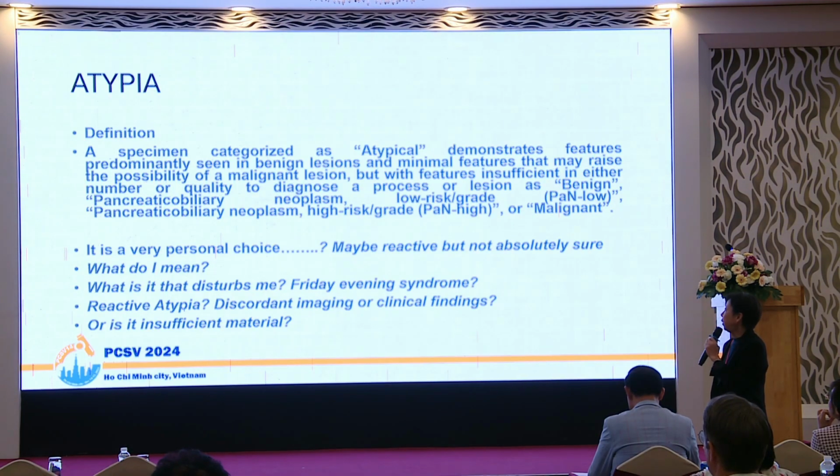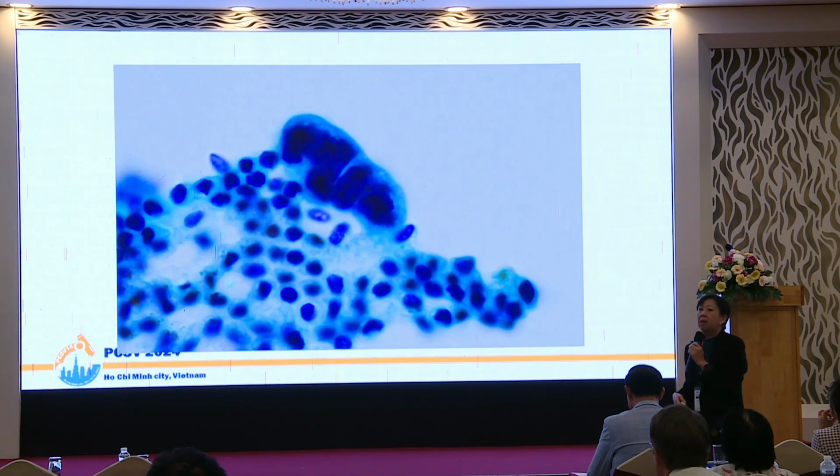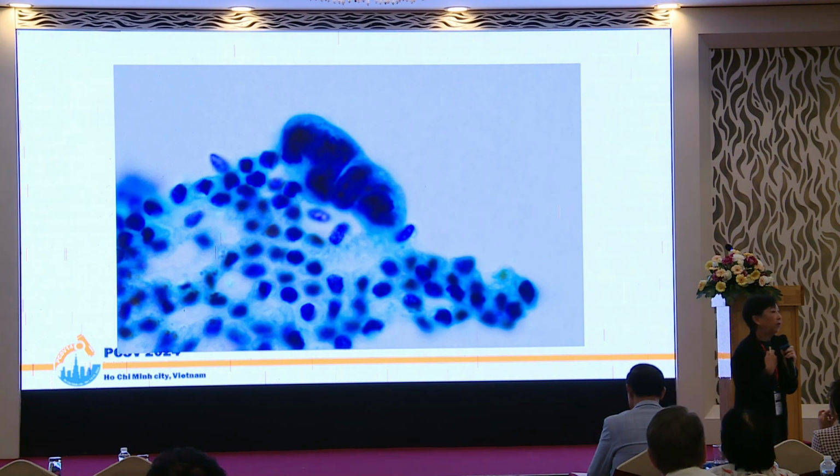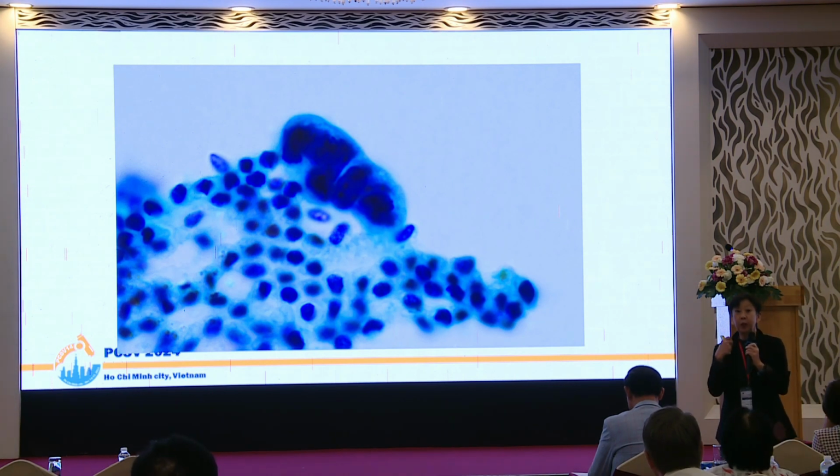So in atypia, what do I mean? Again, we have to be very, very confident in telling the clinician, I don't know. Because we as pathologists sometimes want to tell the clinician, yes, I know what it is, it's this. We want to play God.